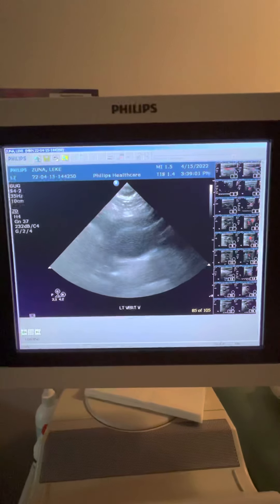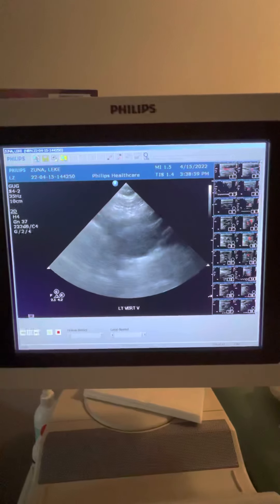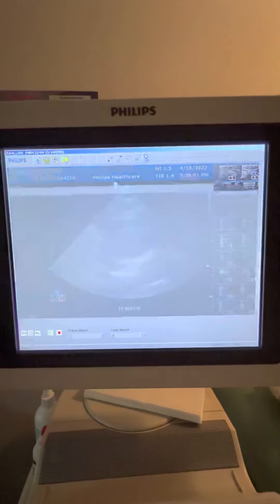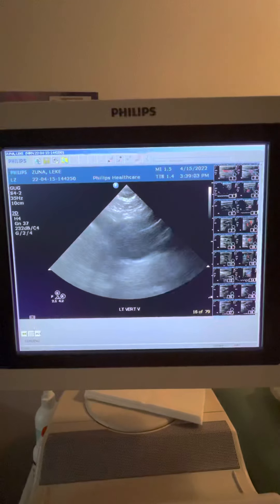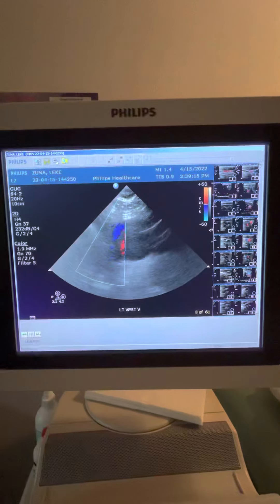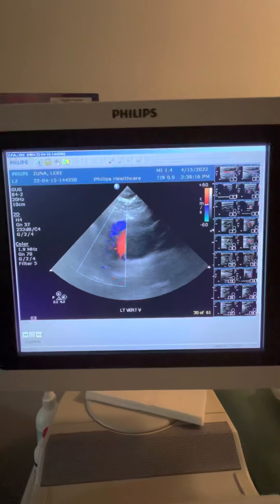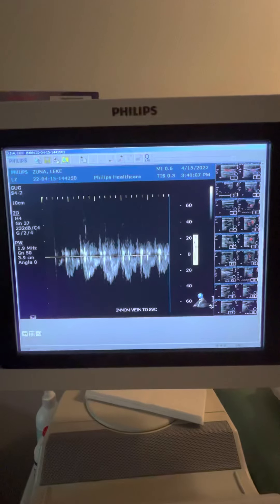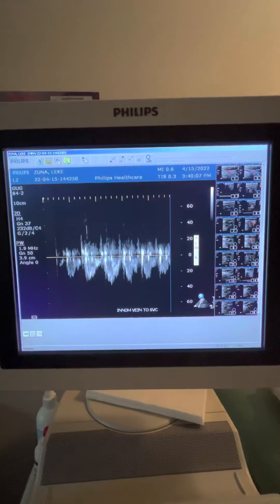Cardiac study, innominate vein to SVC flow. SVC flow and innominate.